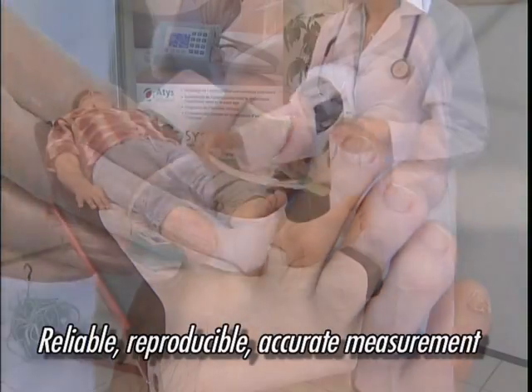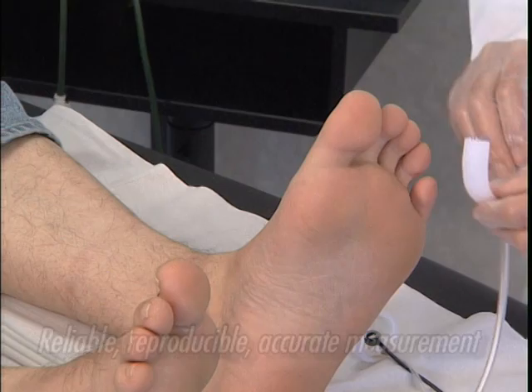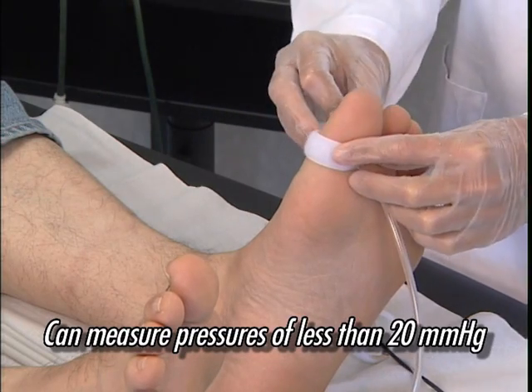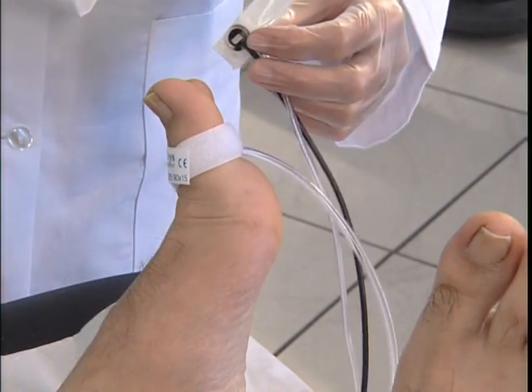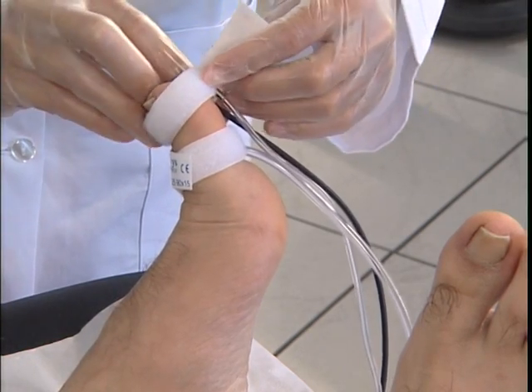This measurement is reliable, reproducible and accurate. The device is very sensitive, being capable of measuring pressures of less than 20 mm mercury. The Cysto system has been validated at the vascular testing department of Nîmes University Hospital.